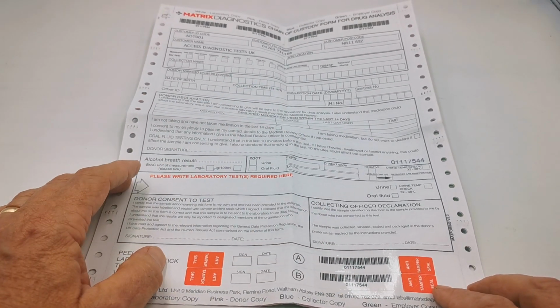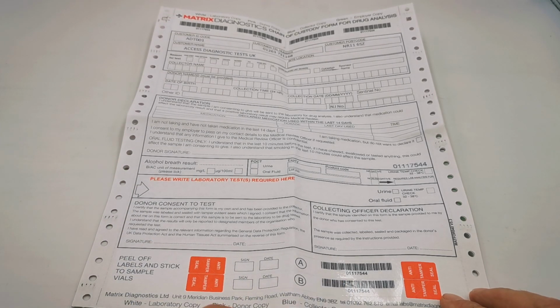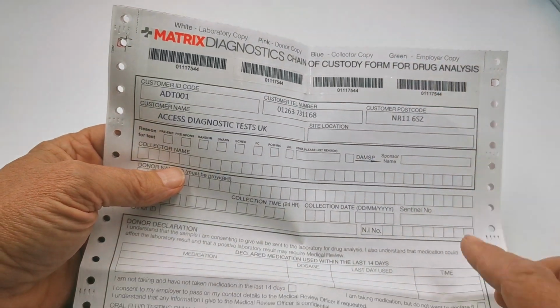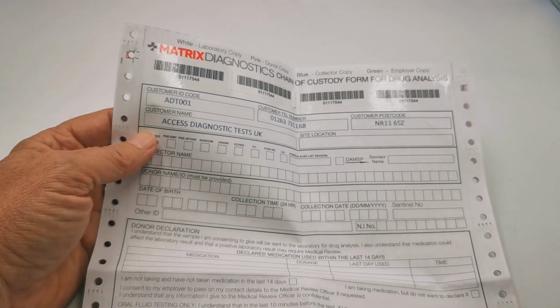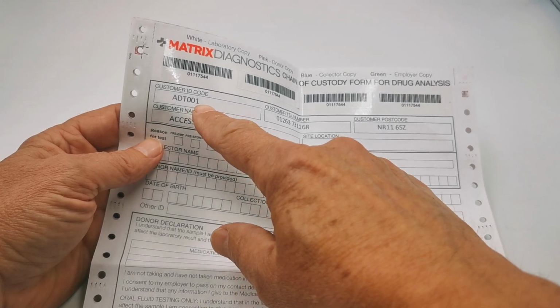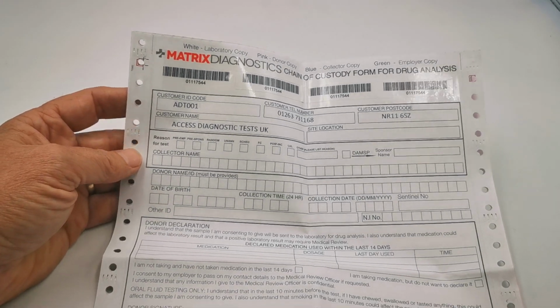Now, the form itself has barcodes and security seals which have to be signed, peeled off, and applied to the two samples which are collected for each of the forms. Additional barcodes are here along the top section of the form. Now, the customer that has provided the form for you, i.e. you have purchased this from Access Diagnostic Tests UK, and our customer code ID for the results to be sent initially to us before we relay them to you are on the top section.